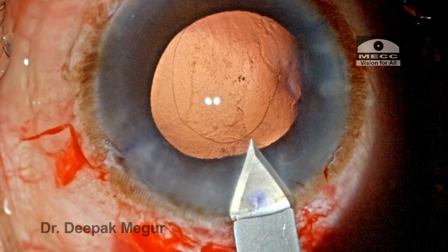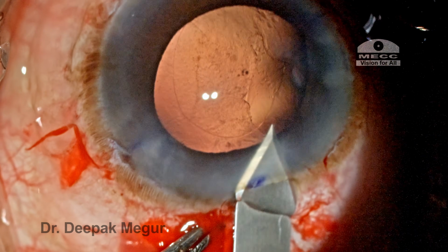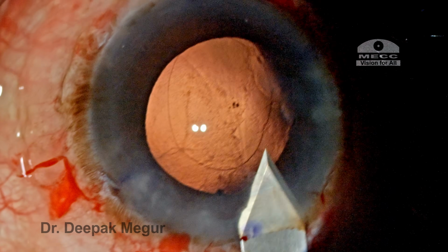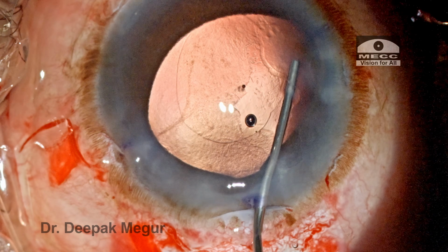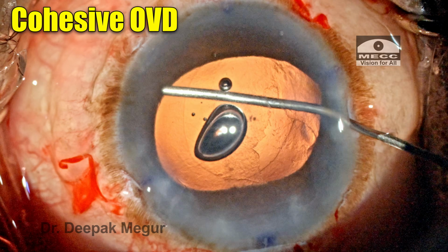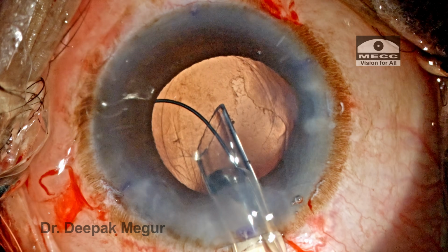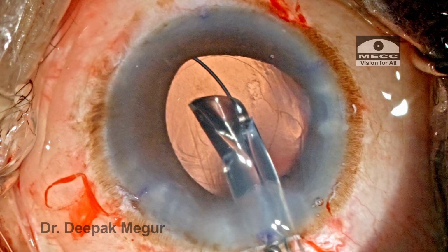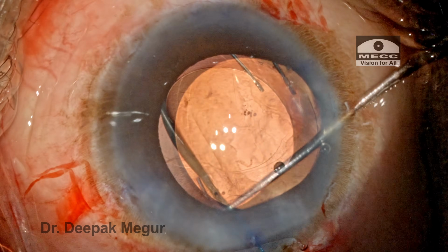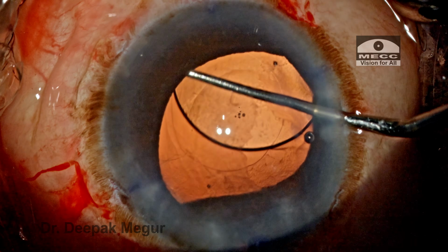Let me remind you that it's worthwhile to extend the incision a little bit wider in cases where vitrectomy has been done, because the eye would be very soft and navigating the cartridge can be a little bit of an issue. Cohesive OVD is used to create space in the ciliary sulcus. So we have enough space between the iris and the anterior capsule, and the lens, which is a multi-piece hydrophobic lens, is gently navigated. The distal haptic goes in first, followed by the proximal haptic, and now both the haptics are dialed in and they are in the sulcus above the anterior capsule.